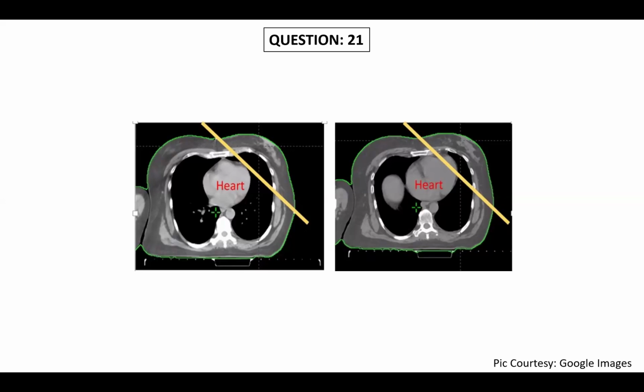Is it helpful for all patients? Mainly left side breast patients will benefit more from this, sir. In all left breast patients, is it helpful for all? Yes, sir, like physically fit patients. No, you may not always get the advantage because the separation is not good. If you don't get proper separation, you will get just a 1.5 gray difference with DIBH versus without DIBH.